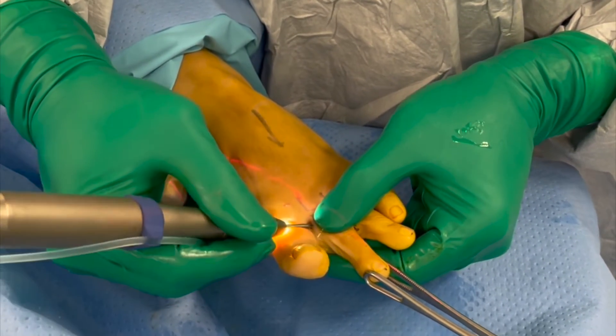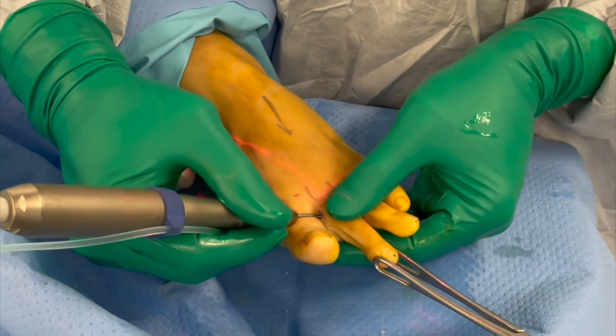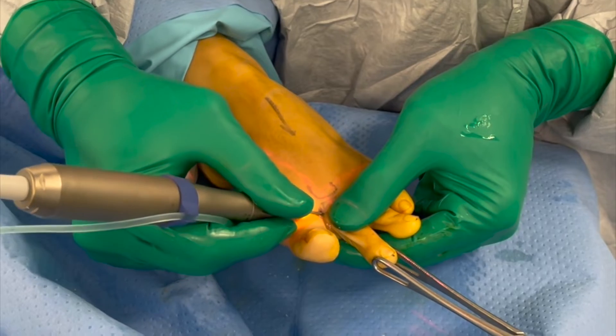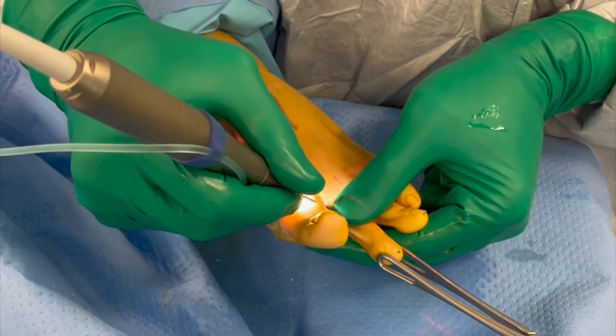The tip of the burr is then positioned back into the proximal phalanx to rest just above the plantar cortex, with the position checked on the image intensifier. The tip of the burr is inserted through the far cortex and the whole plantar cortex is cut with the burr.